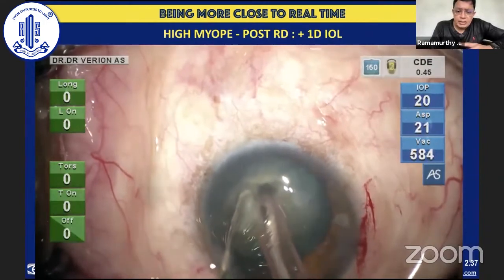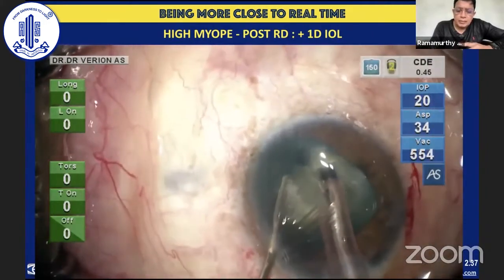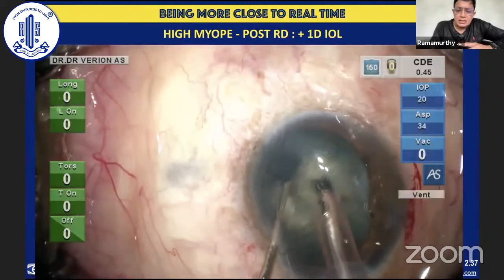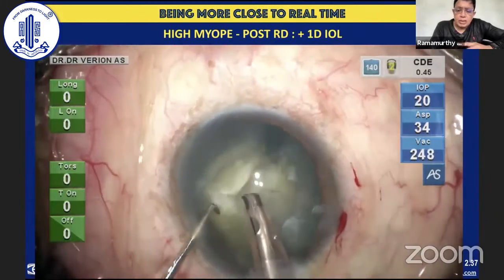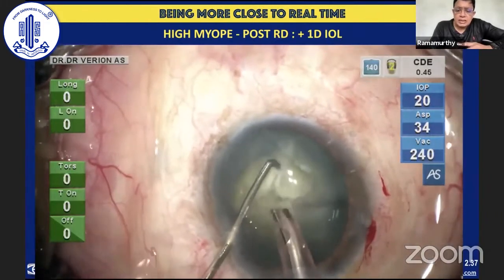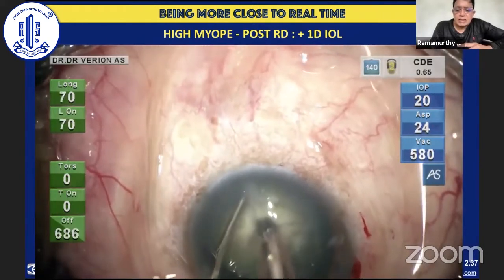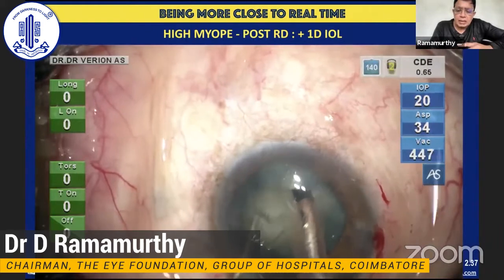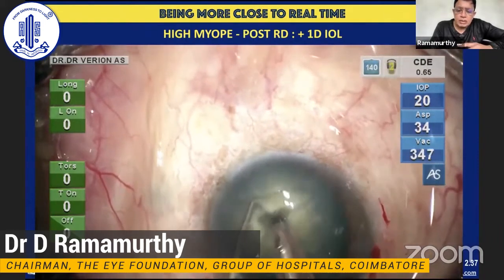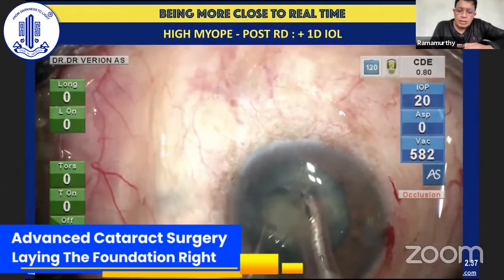You can see the intraocular pressure. I keep it at 20 in this particular case because I don't want the anterior chamber to be too deep. You can see a certain amount of striations and folds on the cornea developing. That often happens when you keep the intraocular pressure very low. So most often I keep the intraocular pressure at around 30, which translates to a height of about 41. But in this particular case, I'm keeping it at 20 because I do not want iris retropulsion to occur or the chamber to deepen.